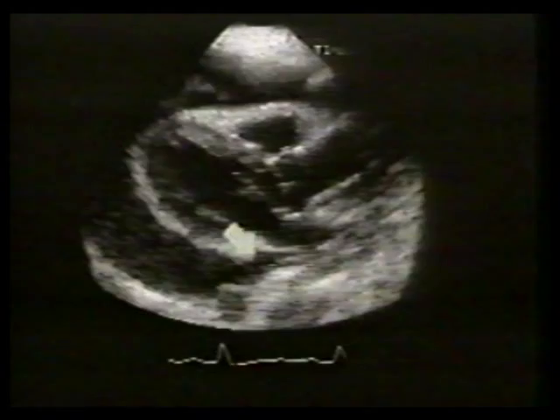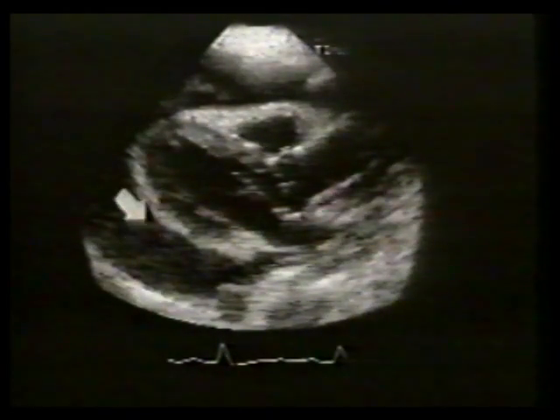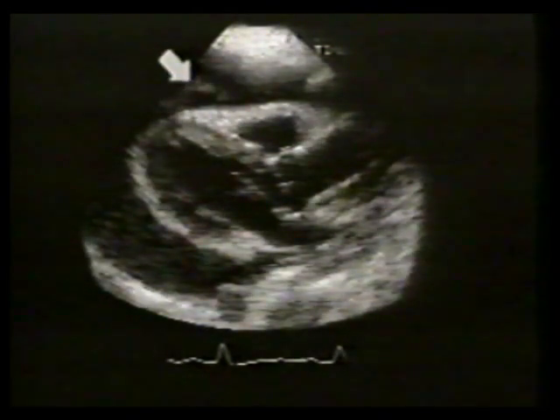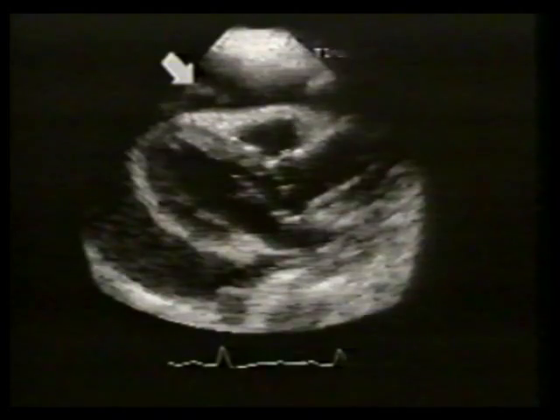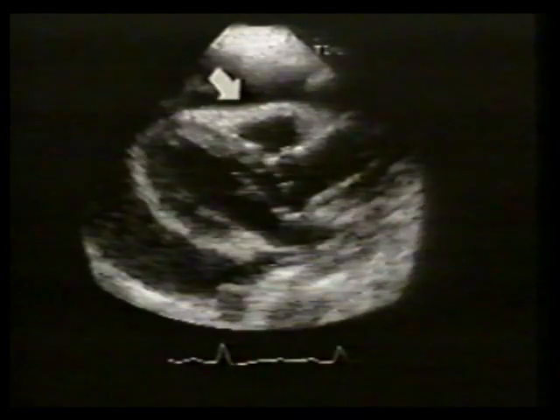The epicardial surface is ragged in appearance, and there are clumps of echoes floating within the fluid and attached to the epicardial surface. In real time, you will see that the heart swings slightly within the large effusion, and you will also see diastolic collapse of the right ventricle, a feature of tamponade which we will discuss later.